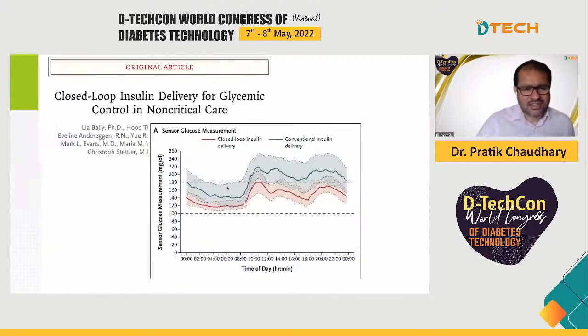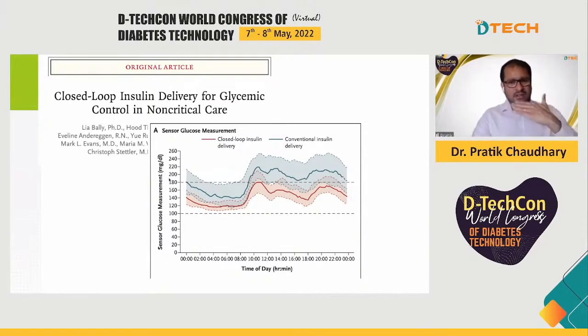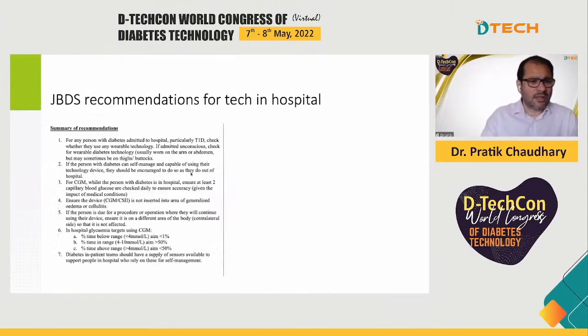And of course, these sensors are now accurate enough that you can use them to drive closed loop therapy in non-critical care. And that to me is the biggest thing, saying that we're happy to guide therapy using these sensors in hospital for people who are not unwell.